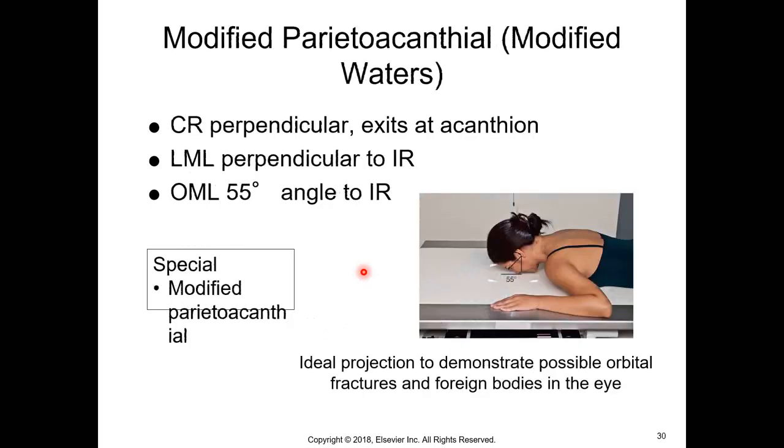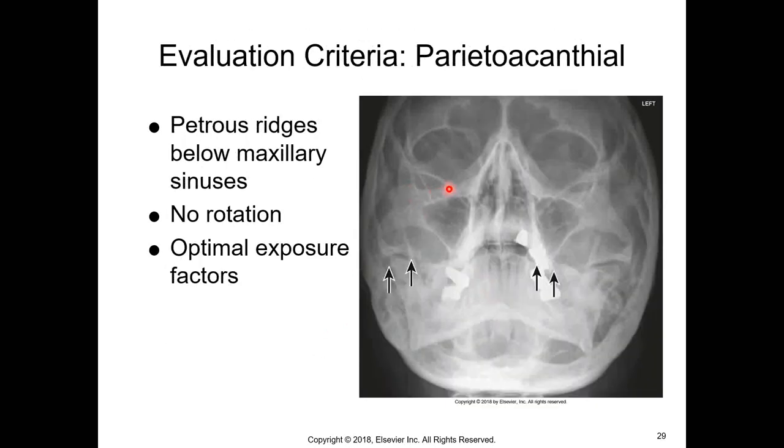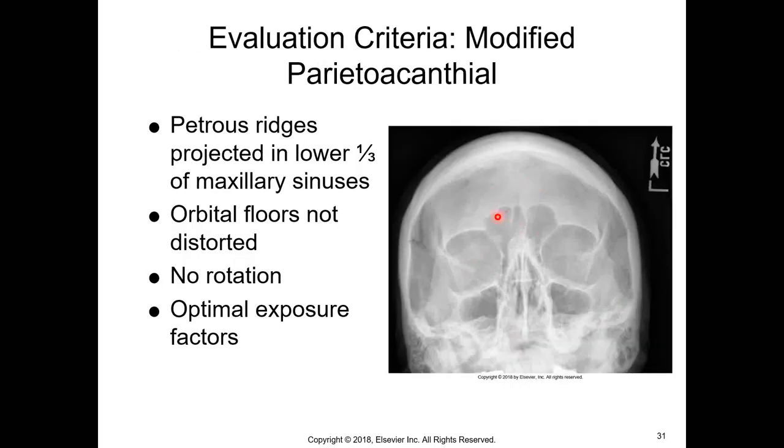And I just want to go back and show you. Notice they're not nice and round on the regular Waters. They're superimposed, but on the modified Waters, they're nice and round and open.